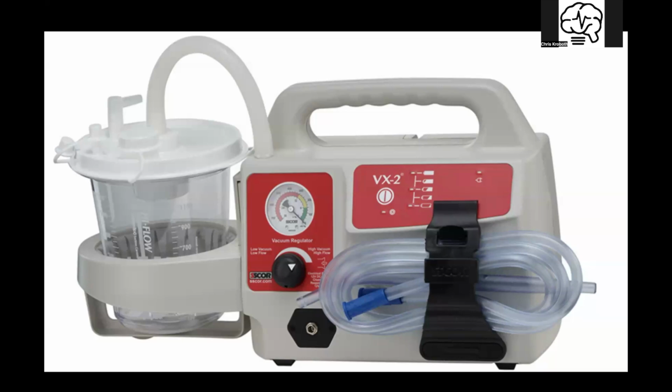Here's a suction unit. A suction unit is nothing more than a vacuum. All it's doing is creating a negative pressure state in this canister, drawing the contents from the tube in, trying to create that neutralized container. This is the dial. In this example, this would be the on button. This would be the battery level. And this is the dial to tell you how much negative pressure or vacuum you create.